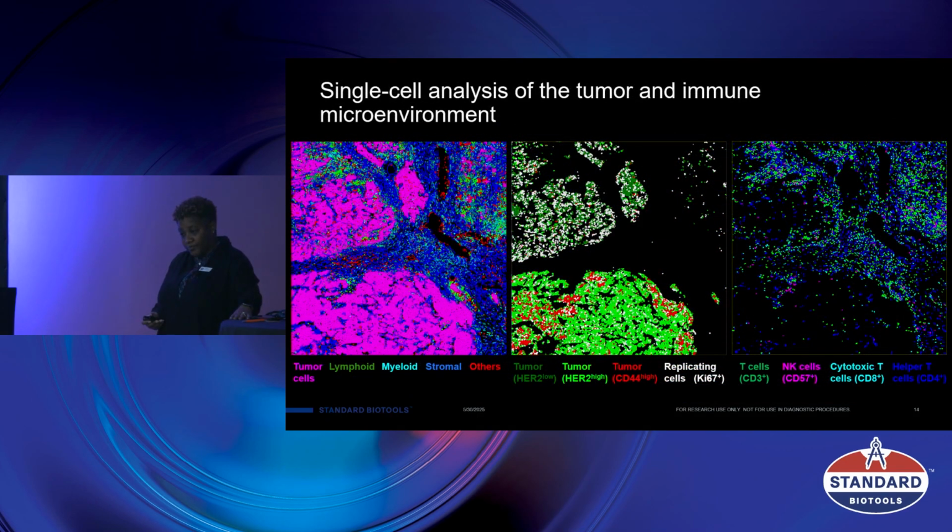When we dig a little bit deeper, we can see in the image on the left that utilizing QPath with the region detection, we were able to identify the components of the extracellular matrix, vasculature, as well as other lymphoid cells. Within those populations we have different subtypes of the tumor cells, as well as replicating cells. Looking even more, you can see where the immune population is, mainly in the extracellular matrix in relation to the tumor. So spatial profiling or resolution permits detailed analysis of the cellular interaction, as well as being able to go back and co-localize that on the tissue to see where everything is, to receive critical and quantitative biological insights in your tissue.